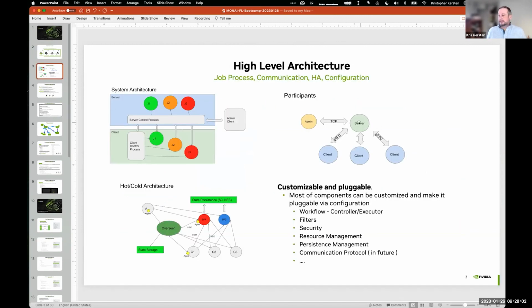So just to set the stage for the high-level architecture, this is stepping back to look at more the capabilities of FLARE and what a real-world deployment looks like. On the top right, this is our hub and spoke cartoon where you have a FLARE central server that's performing aggregation of a model that's trained on a set of distributed clients. And on the left, you have an admin client that's used to manage the federation as a whole. So this would be controlling the clients and server, checking status, looking at logs, deploying applications.